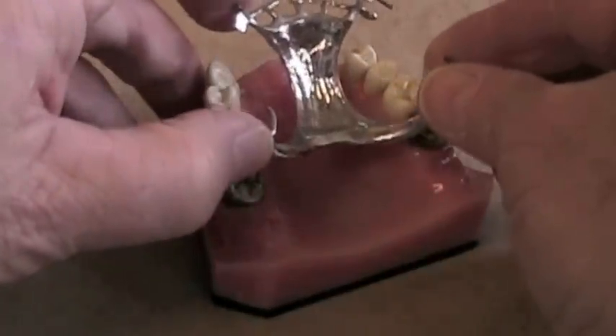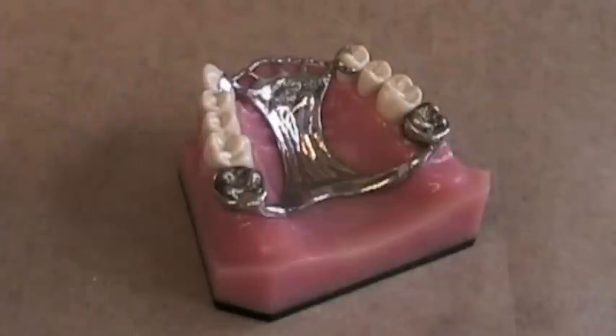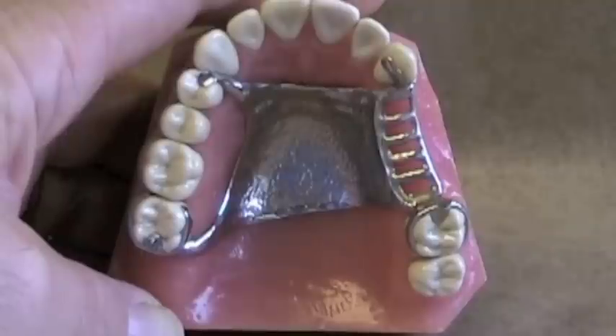We've talked about preparing guide planes to dictate a single path of insertion for a removable partial denture and how important those guiding planes are. That's important to give us some frictional retention and also to limit the amount of undercut that our metal flexible clasps go into.